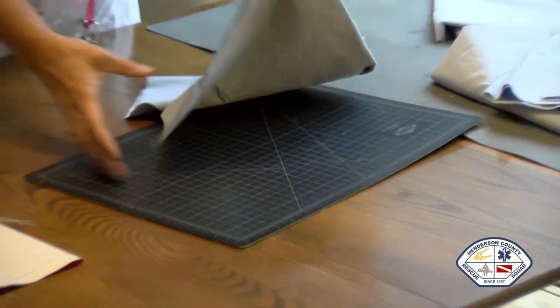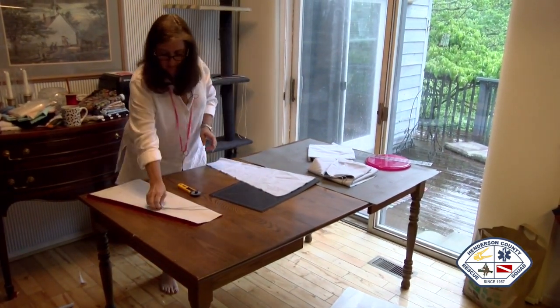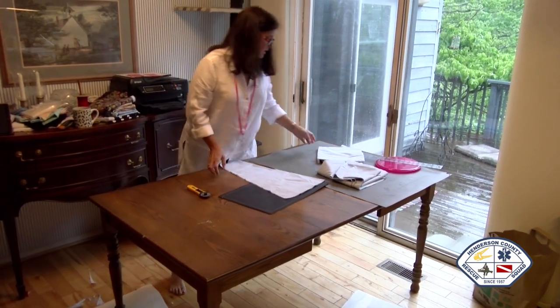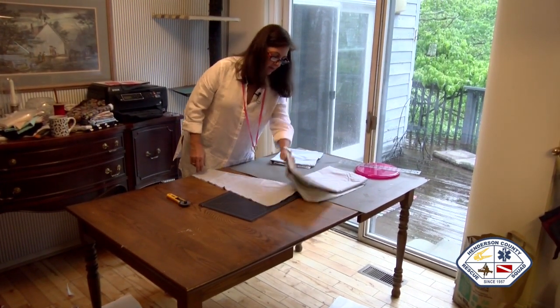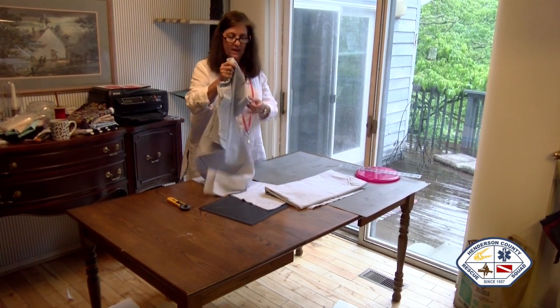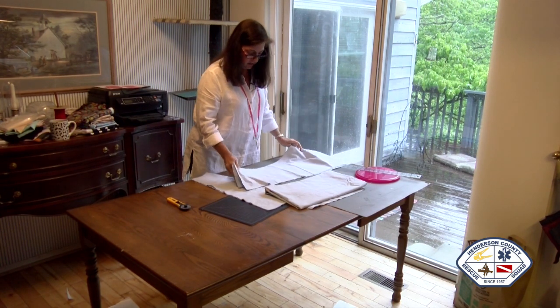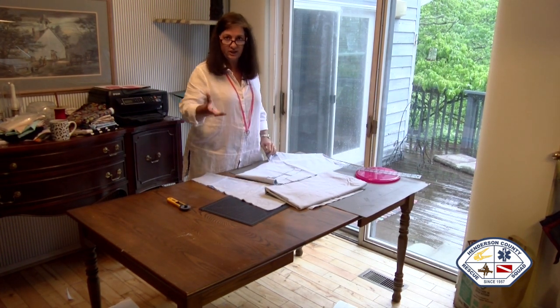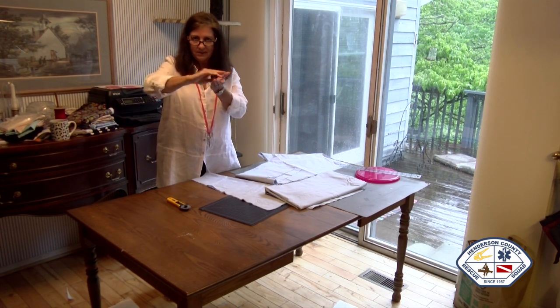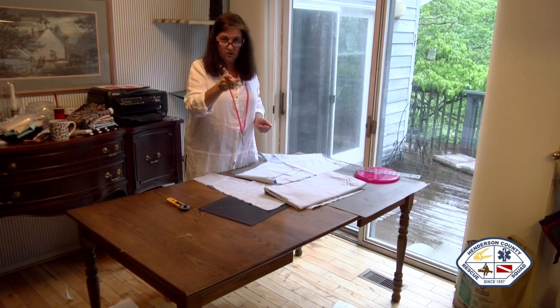Perfect. Now we've got a curve there. So we have 2 pieces. We have the gown and we have the sleeve. You then end up with extra fabric. Along the bottom of most sheets, and I'm using a sheet, is the edge that's turned under and hemmed. I trimmed that off, and we're going to use that for something else a little bit later.